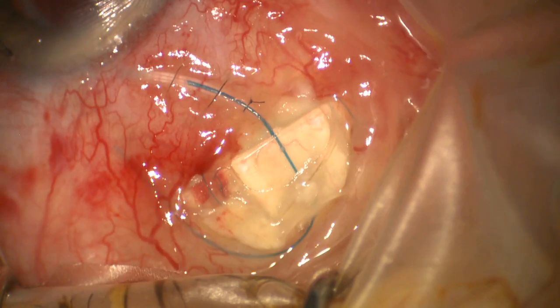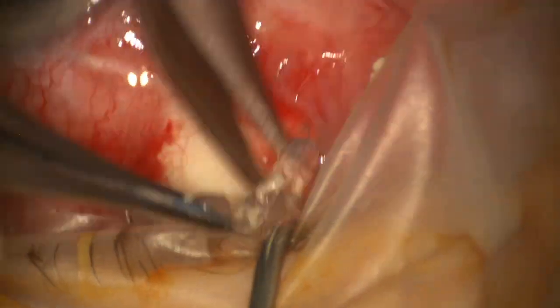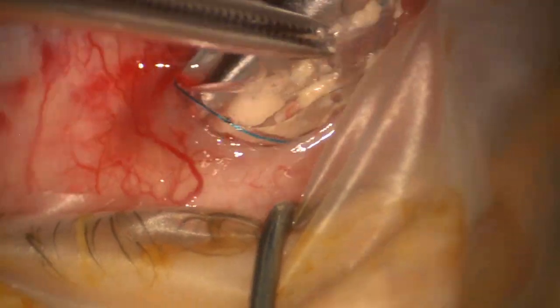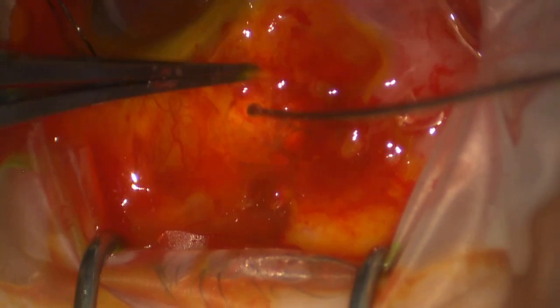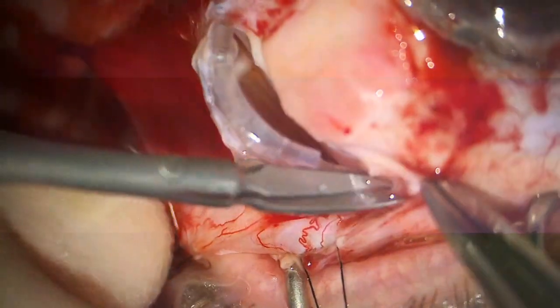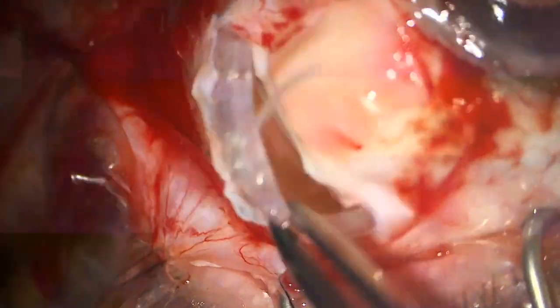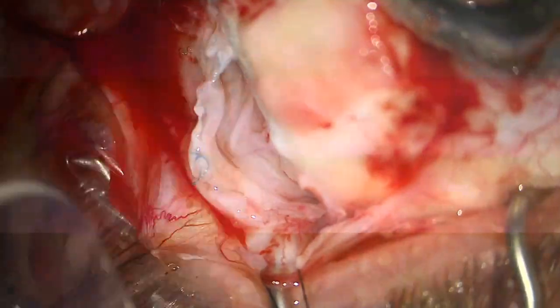The only thing about removing implants, for those who are unfamiliar with this territory, is that you've got to cut all the pegs at the back, otherwise you can't get the thing out. That's true. The one I showed earlier wasn't really anchored down because it hadn't been there very long, but you can't really see it there. But you've got to get these. There's a good example of fibrous pegs, and you can be pulling and wonder why it won't come out, and then try and chop up the implant. But in fact, all you need to do really is get at those pegs, and that's pretty much it.